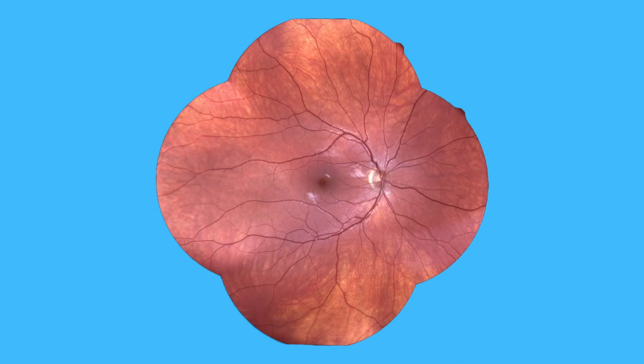We need 1 image of each of the following fundus regions. Always start with a disc-centered image. Then acquire a macula-centered image. Then 1 from temporal of the macula. Next, we will image the vascular arcades, beginning at the superior arcades, 1 of the temporal one and 1 of the nasal one. Lastly, you need to image the inferior arcades, again 1 of the temporal one and 1 of the nasal one.